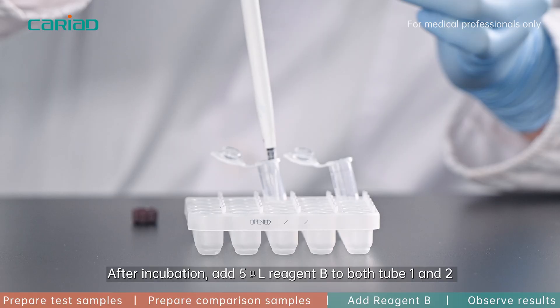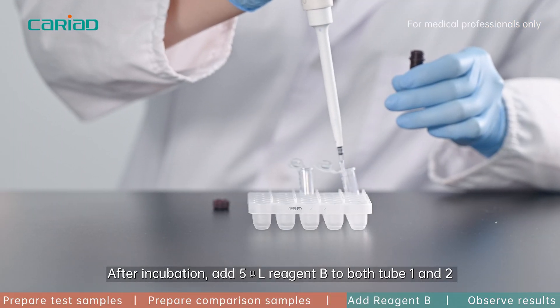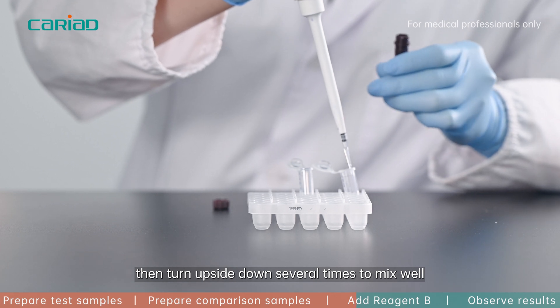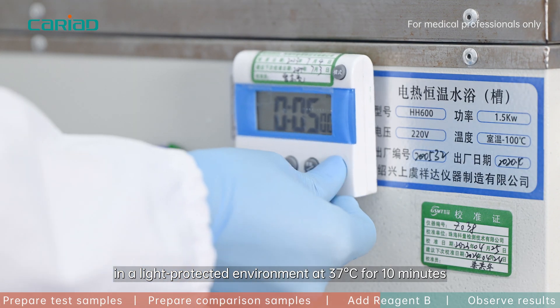After incubation, add 5 microliter reagent B to both tube one and two, then turn upside down several times to mix well. Incubate both tubes in a light-protective environment at 37 degrees Celsius for 10 minutes, turning upside down several times every five minutes.